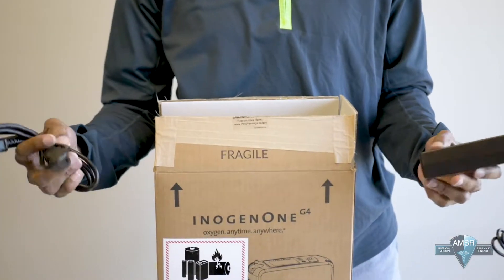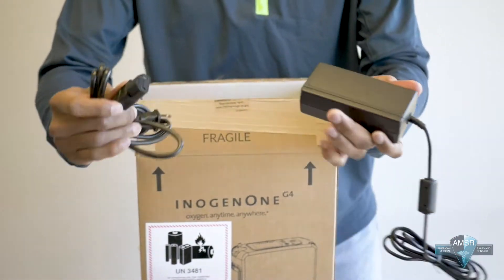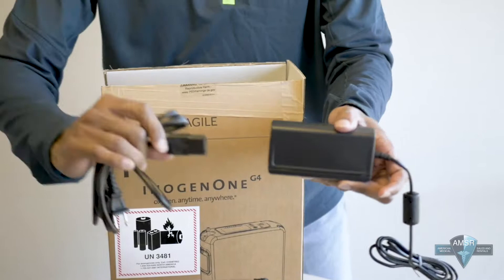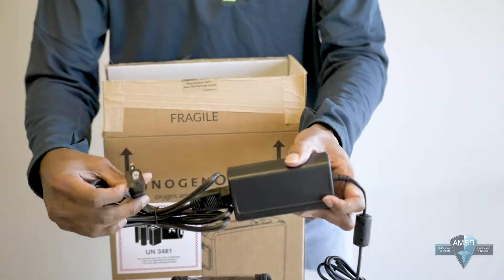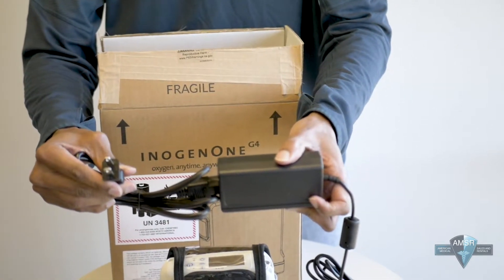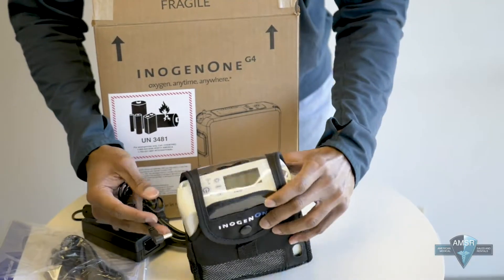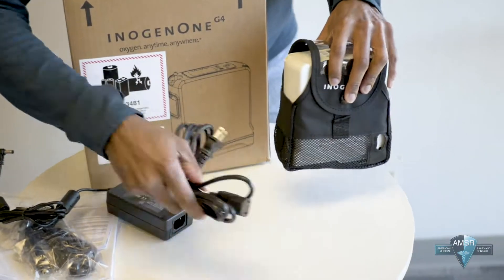This is the other adapter that you get with the machine — it's the AC adapter. This can be plugged into any AC outlet and comes in two parts. This is basically the power block, and you just take the other cord and connect it in, and then you have the end that plugs into your AC outlet and the other end that plugs into the side of the unit at the bottom.